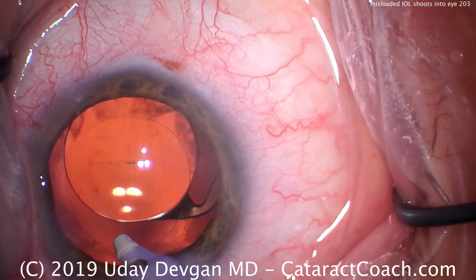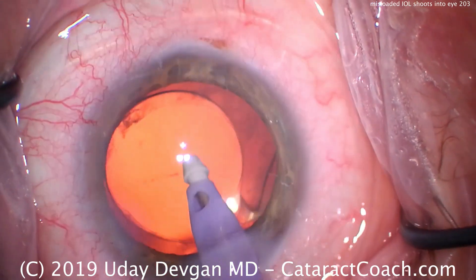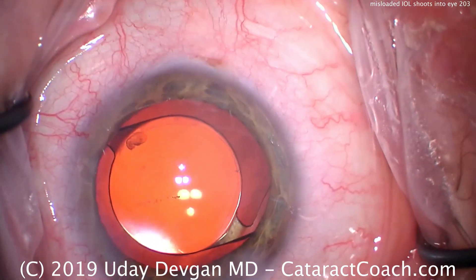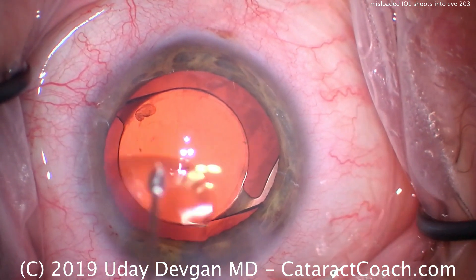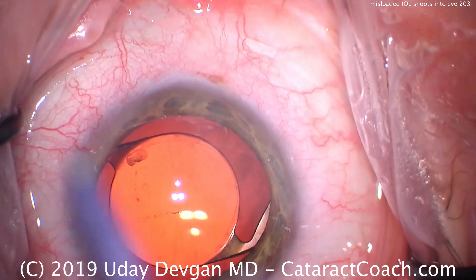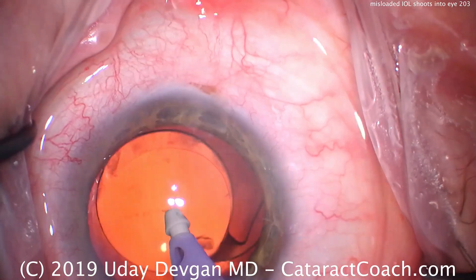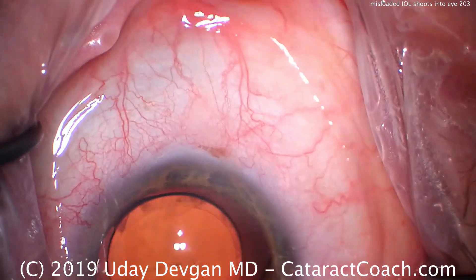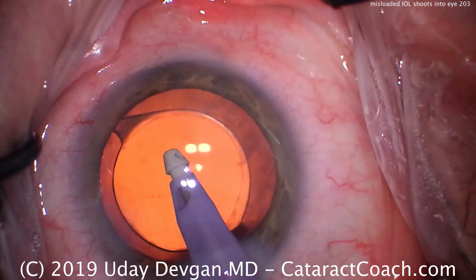And now that's definitely inside the lens material — that's not going to go anywhere. And now when we think we're done, look — there's a little piece of cortex near the haptic-optic junction. Another little opacity there. Should we leave that? No, I don't think we should. So let's go underneath here again, lift up, and get that little last piece. There it is. That's better.